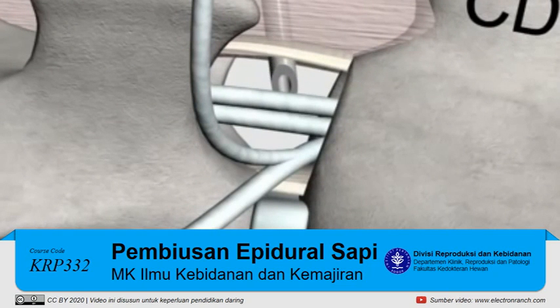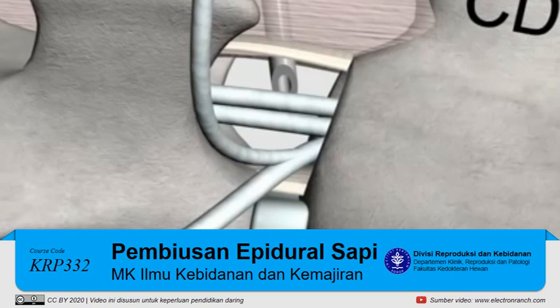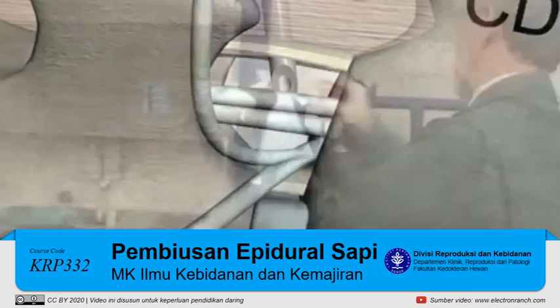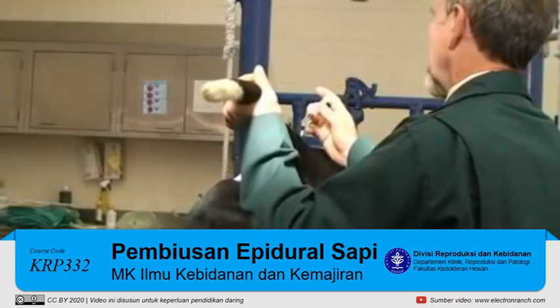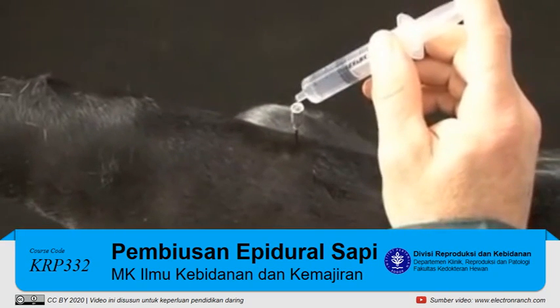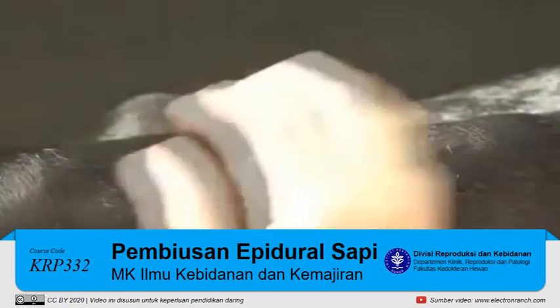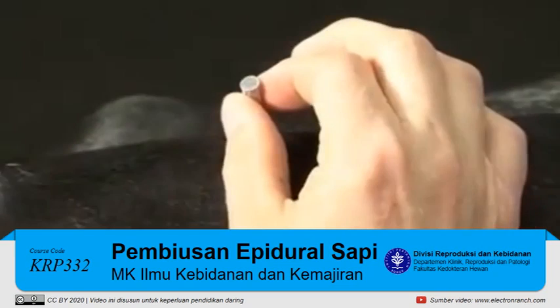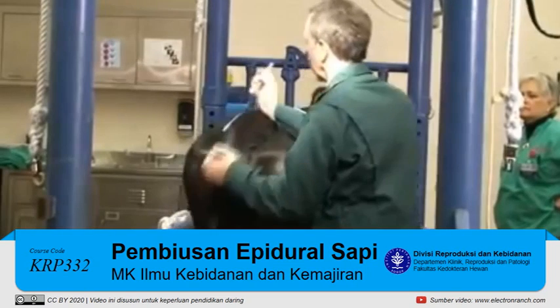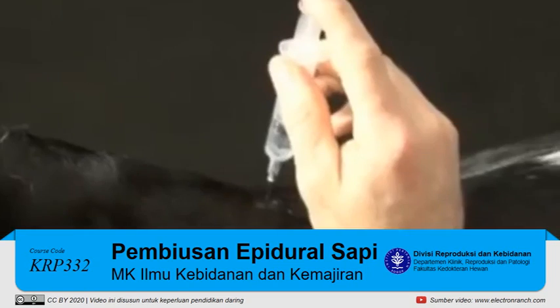You may also hear the faint sound of air rushing into the epidural space as the negative pressure is relieved and the epidural space expands. Many clinicians will confirm proper needle placement by instilling one or two drops of anesthetic from the syringe into the hub of the needle. If necessary, gently redirect the needle until the fluid disappears.